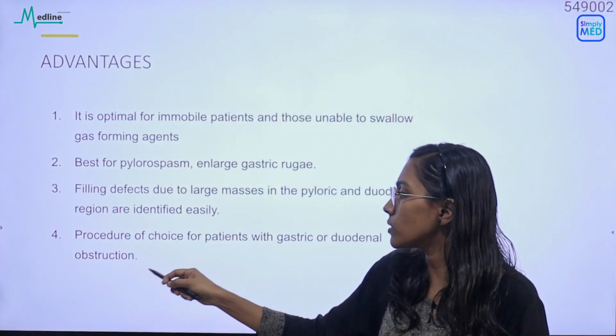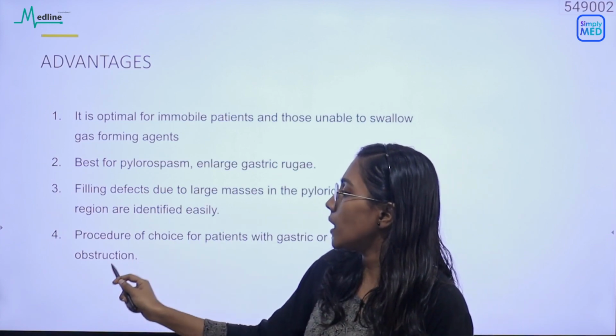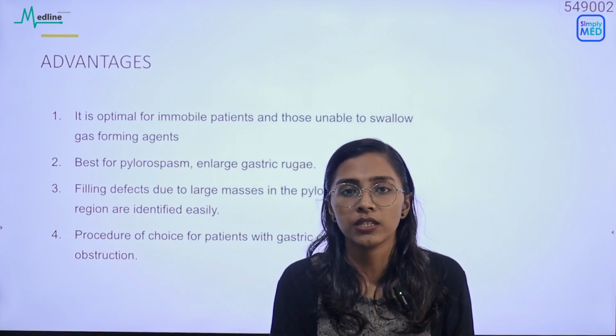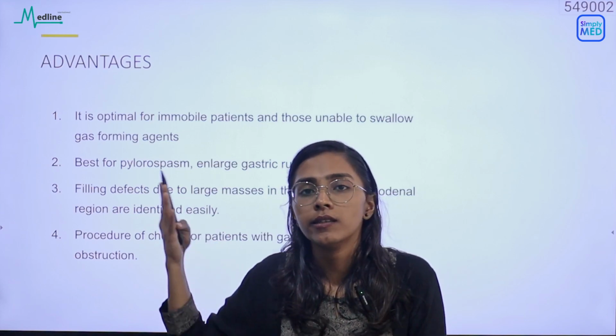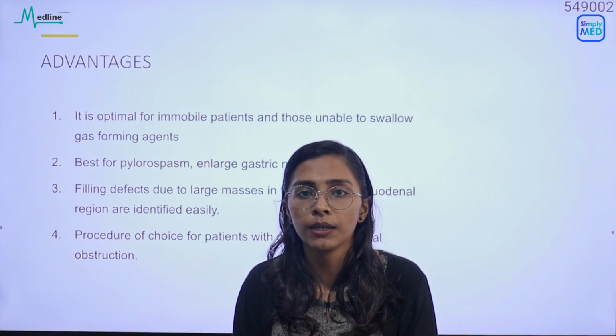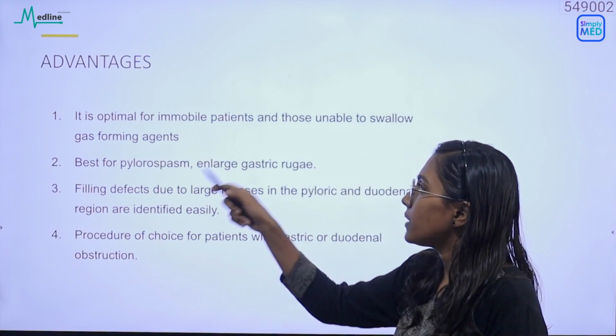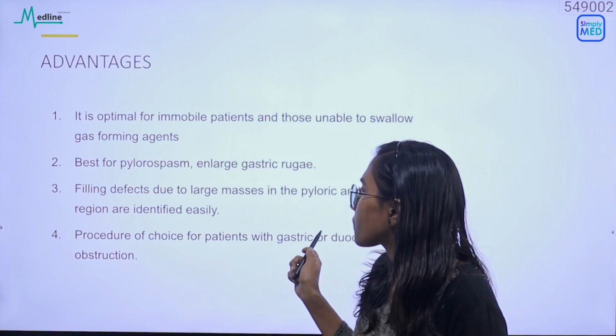Then this is the procedure of choice for patients with gastric or duodenal obstruction. Okay, so if some patient has gastric or duodenal obstruction, then the single contrast study is the best one. Okay, so that's all the advantages of single contrast study.